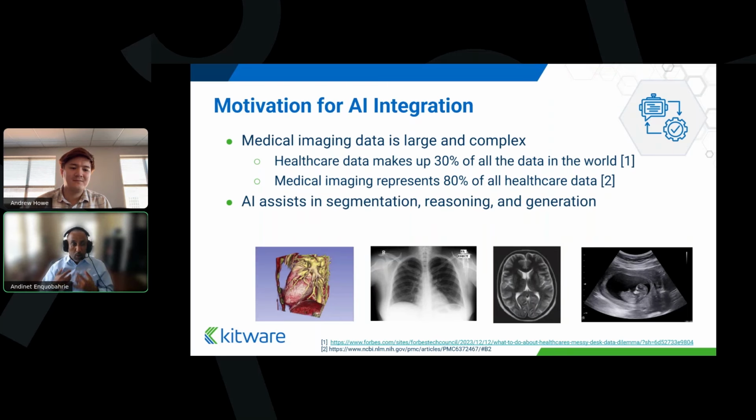Modern AI models can really help radiologists with segmentation, triaging, detecting tumors, anomaly detection, and reasoning about the different findings. All these tasks are very repetitive, and having an AI tool would make it very useful.